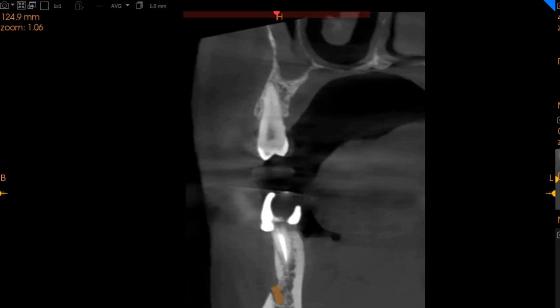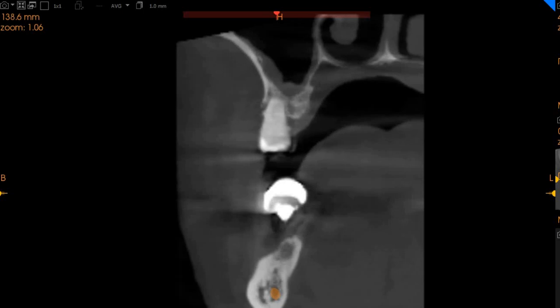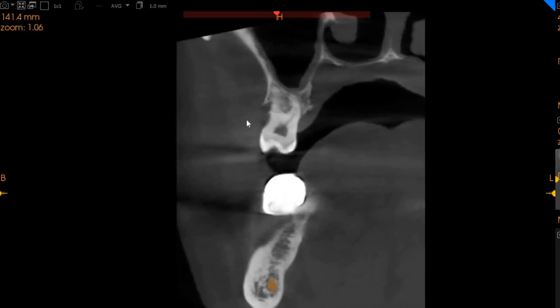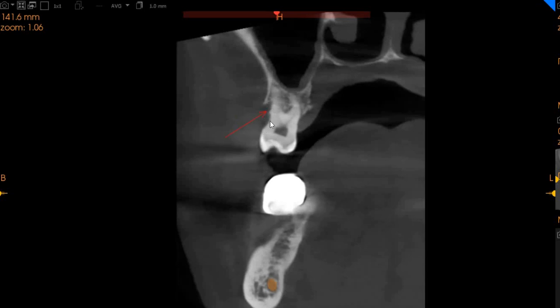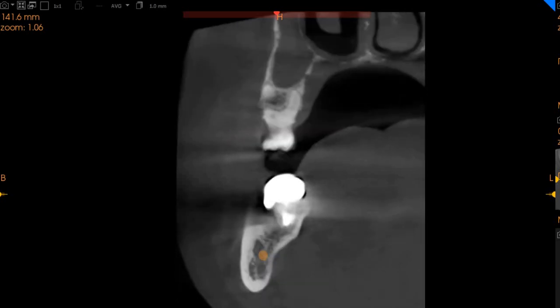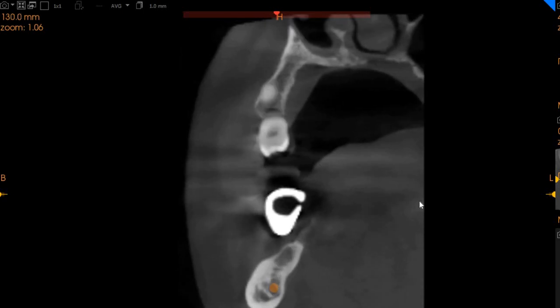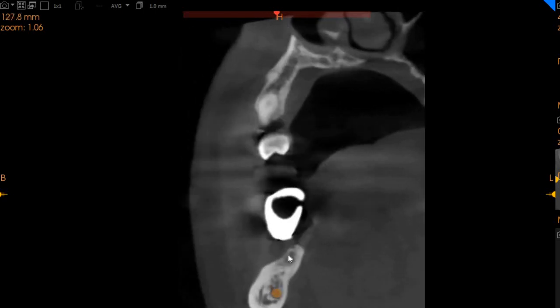The upper left six and seven also show significant bone loss, as you can see right here — significant bone loss with calculus present. This patient is definitely suffering from significant periodontal issues.